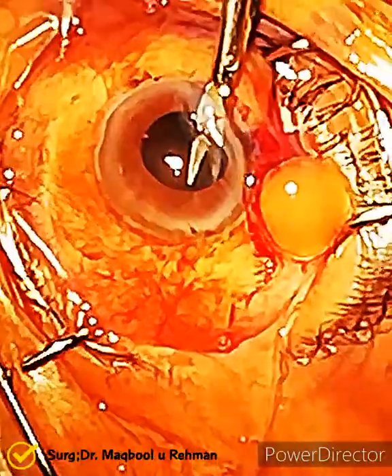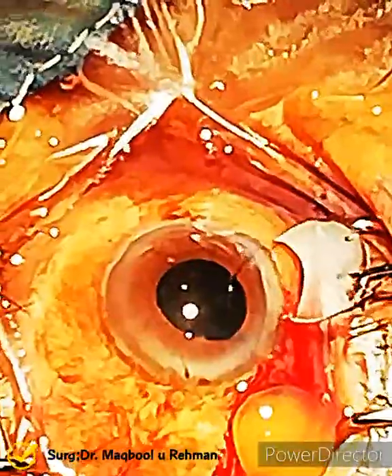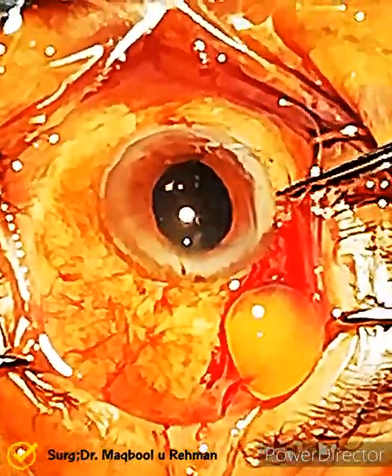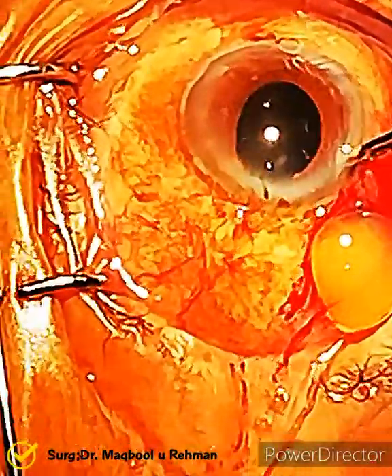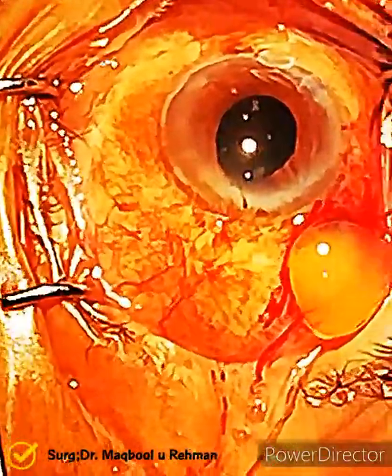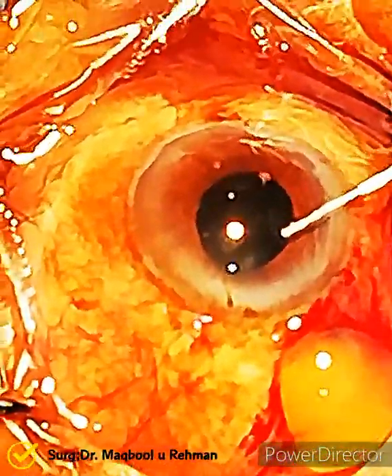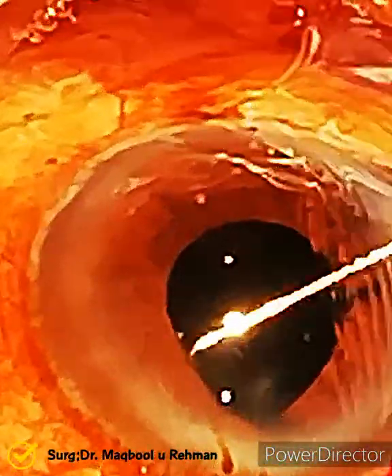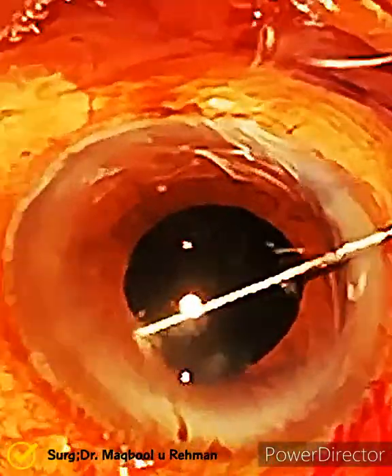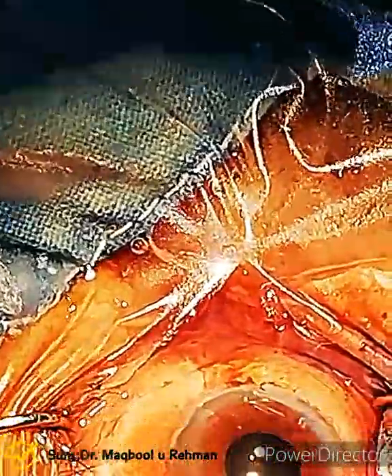Cutting the anterior capsular tag with Vannas scissors. Now it's time for IOL implantation — thank God there is no need for an AC IOL. Dialing the lens into the sulcus. Very nice — the lens is almost in the center, placed horizontally.